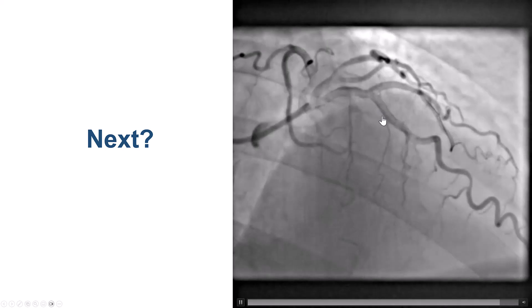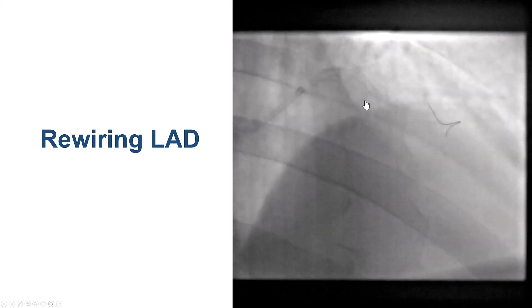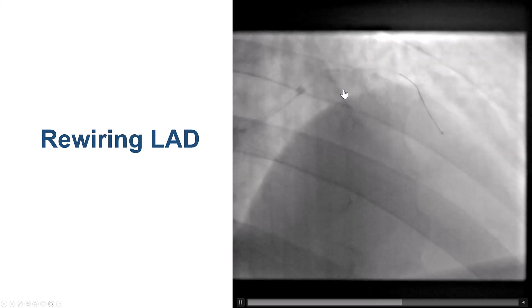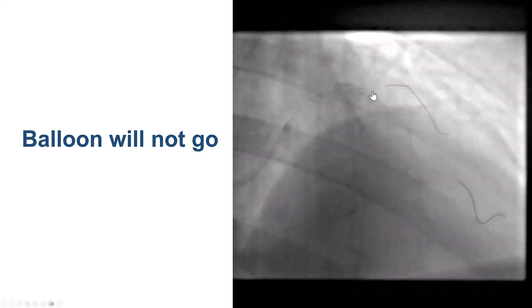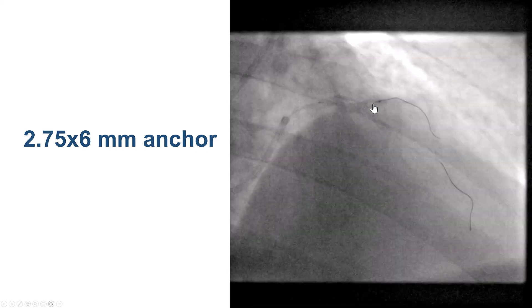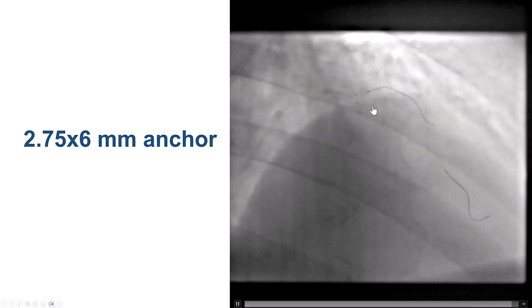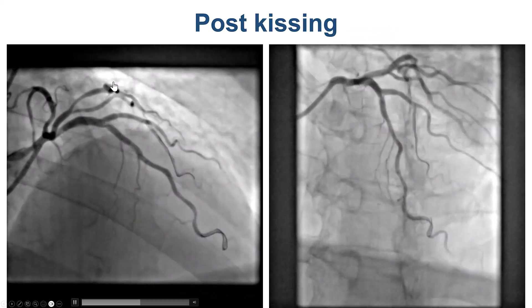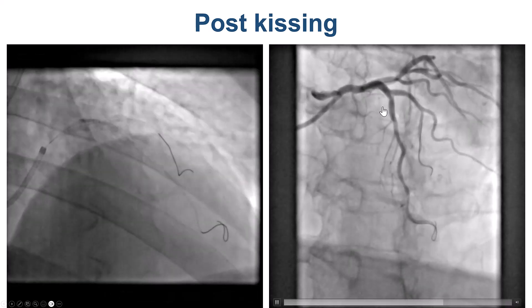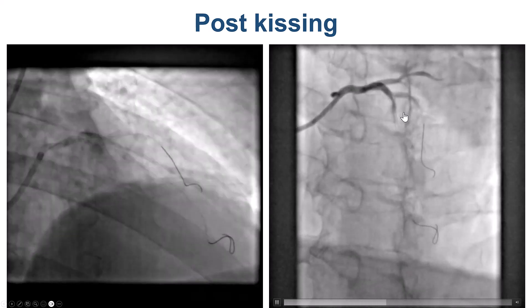We now have TIMI 3 flow into the diagonal and TIMI 3 flow into the LAD, but we need to rewire the segment of the LAD and do a kissing balloon inflation. Before doing that we did the proximal optimization, but then had some difficulty advancing equipment into the LAD. We eventually advanced another guidewire through the stent struts, but a balloon would not go. We used a short 6 mm balloon into the diagonal, which allowed us to advance our balloon into the mid LAD and perform a kissing balloon inflation. This provided a nice result, though there was still some geographic concern about possible under-expansion or covered dissection in the mid LAD after the takeoff of the diagonal branch.